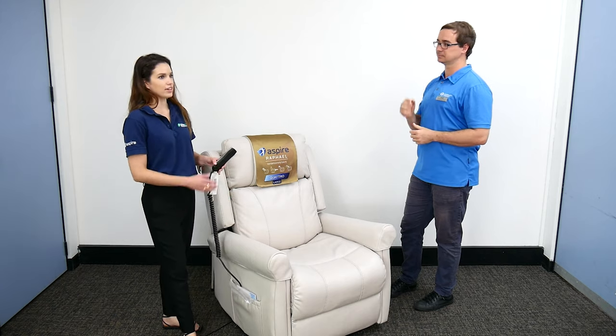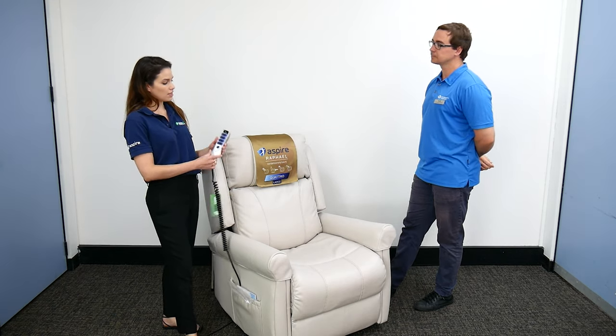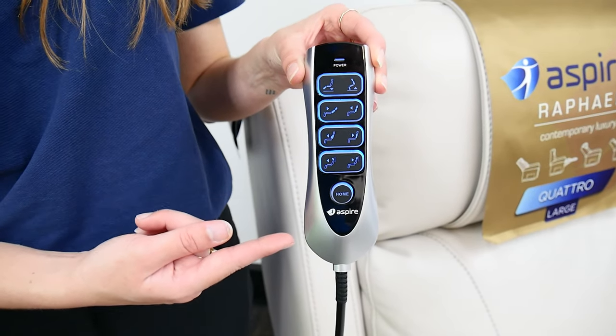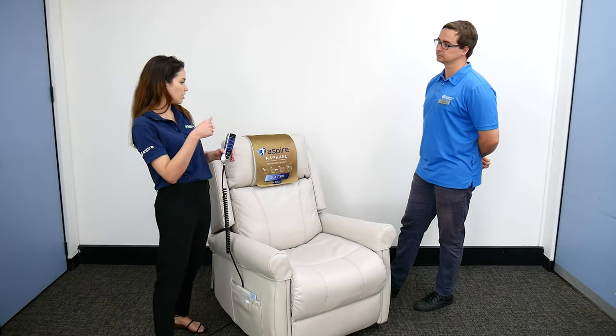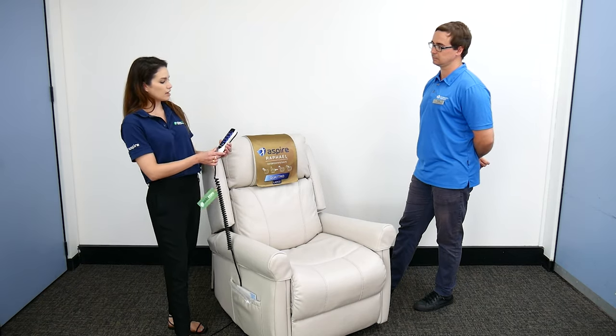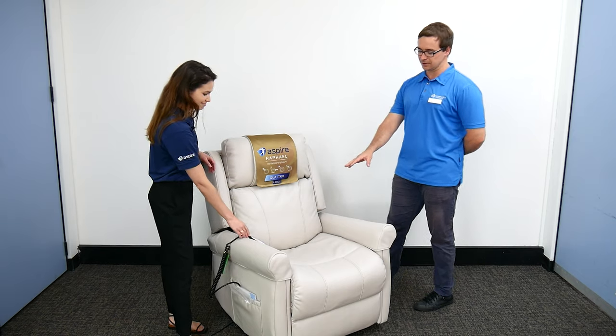If you have a client who has some cognitive concerns or memory loss, they might find the hand control a little bit difficult to use. We do have other options — the single motor has only two buttons. But if you do have someone who's cognitively sound and able to use the hand control, it really is a great solution.